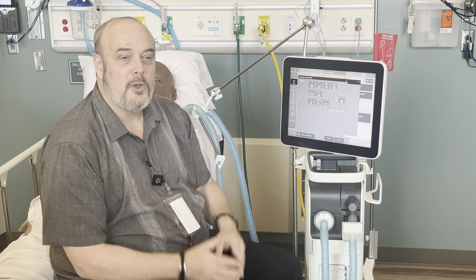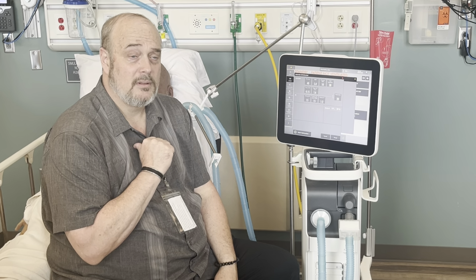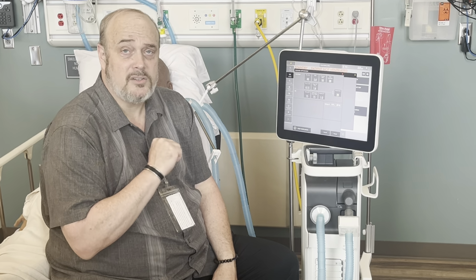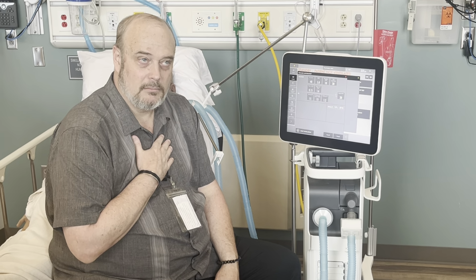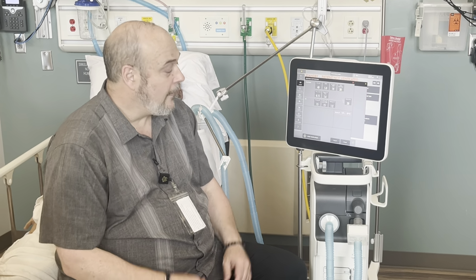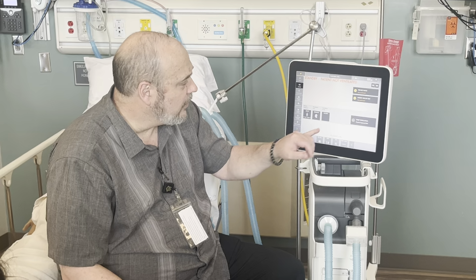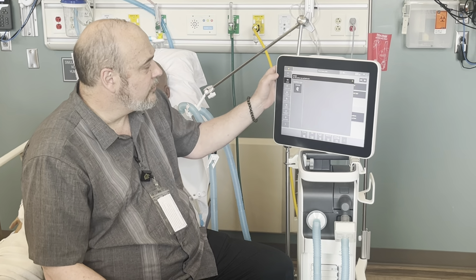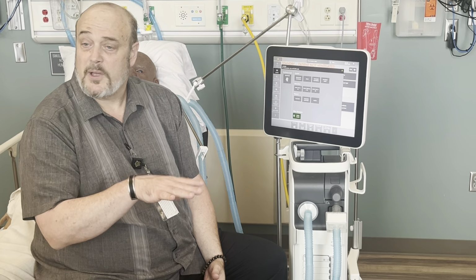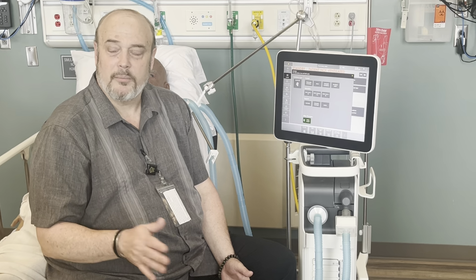This is a spontaneous mode, and you have a spontaneous breath, because I determine when I take the breath, I determine how long I'm gonna take the breath, I determine everything about this breath. That's me. If I take any of that away, it's no longer a spontaneous breath. Whenever you're doing your vent checks, and you're in any of these modes up here, and it gets down there, it'll say spontaneous rate. There's just a total. Spontaneous tidal volume, there isn't one.